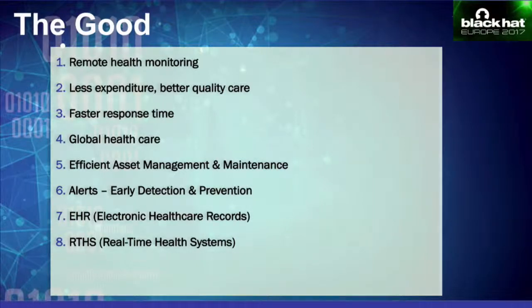The first one would be that since doctors can remotely view this data, a patient won't have to go to a medical institution as often. That cuts down cost on the part of the patient. It also cuts down cost on the hospital side of it. And again, more importantly, it helps with managing the workload of medical practitioners. Your doctors, your nurses, they're often overworked, so it takes care of that part as well.